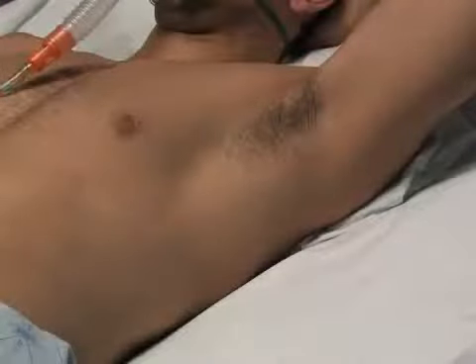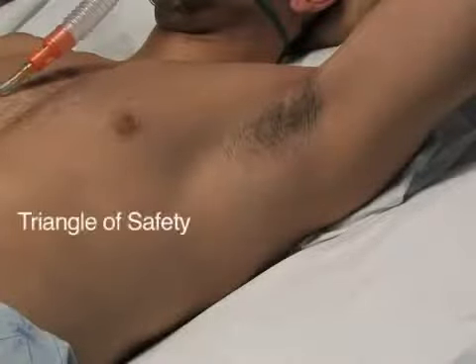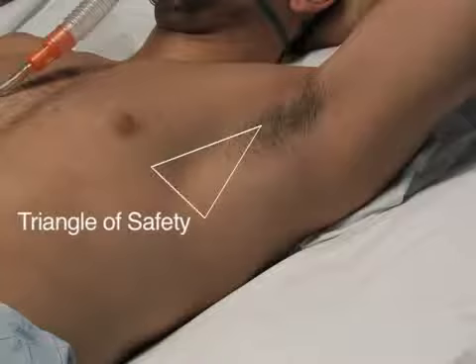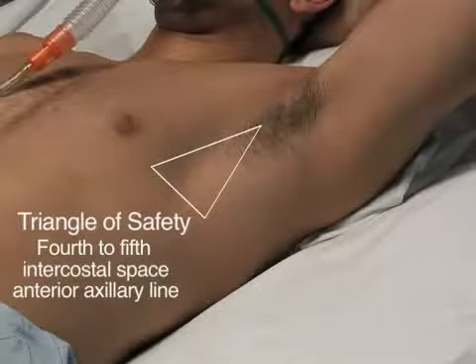The ideal location for the placement of a chest tube is in the triangle of safety, the anatomical region defined by the lateral border of the pectoralis major muscle anteriorly, the mid-axillary line posteriorly, which is also the anterior aspect of the latissimus dorsi, the apex just below the axilla, and the horizontal level of the nipple inferiorly. The nipple line may be an unreliable landmark for female patients due to breast tissue. To help with landmarking, remember that the triangle of safety should approximately lie between the fourth and fifth intercostal space in the anterior axillary line.